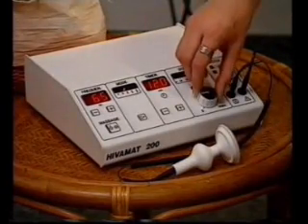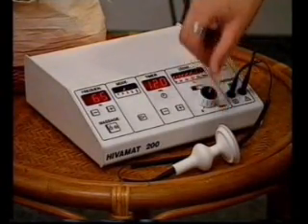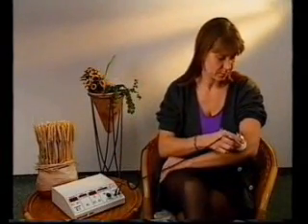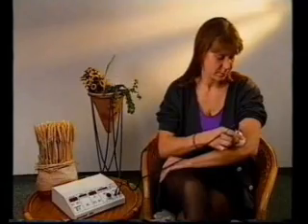The hand applicator can be used for self-treatment. This way, deep oscillation can be performed by the patient at home, supplementing treatment by the therapist or in aftercare.